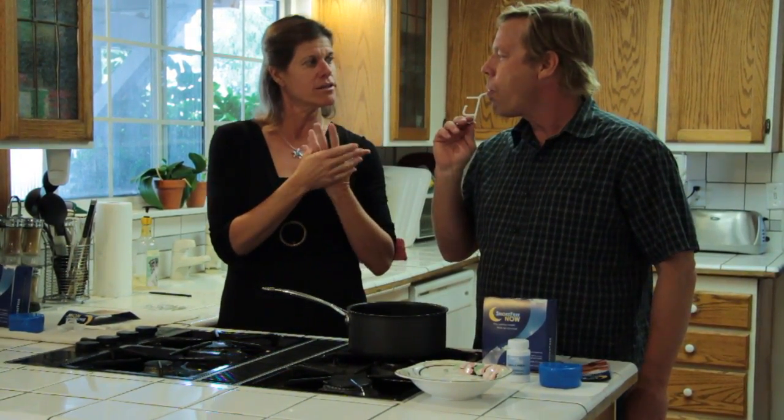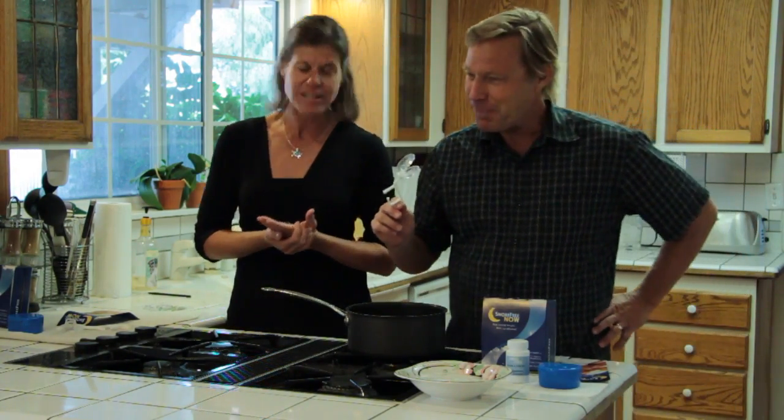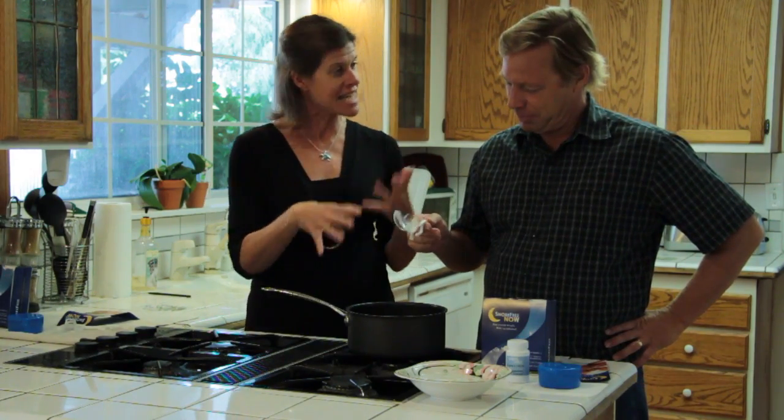All right, so now that you've done that, how's that feeling? Well, I'm going to take it out. It fits, but it's not custom fit yet. It's not custom fit, and that's absolutely correct. But we wanted to make sure that we ran through it as a test, as a practice. So now I think it's time to actually make a custom mold for Roger, so that I can have a good night's sleep.